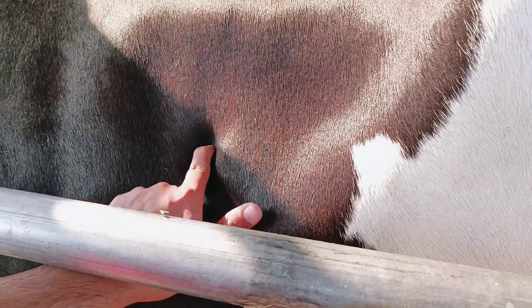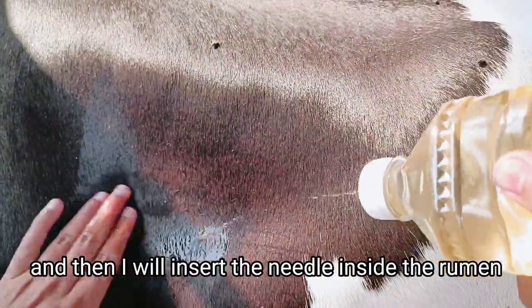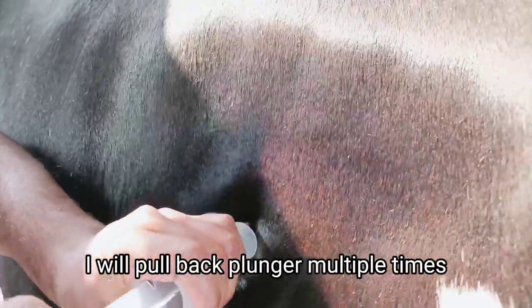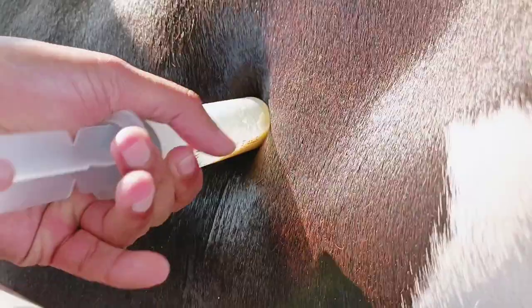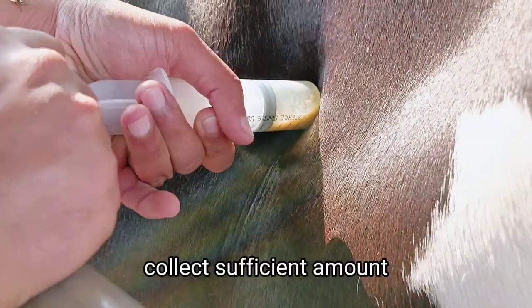First of all we will disinfect this area with methylated spirit, and then I will insert the needle inside the rumen. I will pull back the plunger multiple times. You can see the rumen fluid in the syringe — we have collected a sufficient amount.